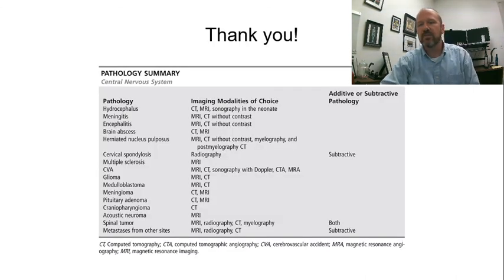So thank you so much. Pretty much everything that we have looked at today is subtractive in nature. I think reinforcing that with the pituitary adenoma, where we actually can see a subtractive thing occurring on a lateral x-ray, is important to remember.